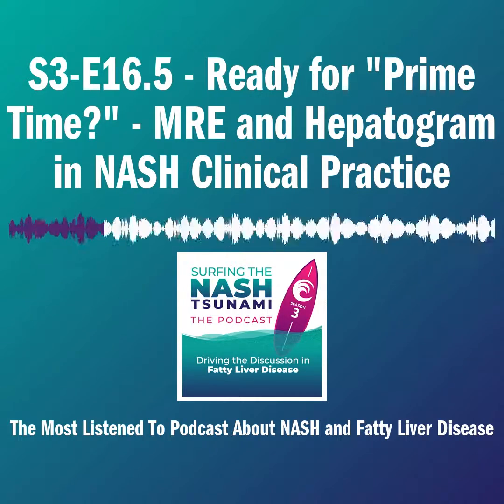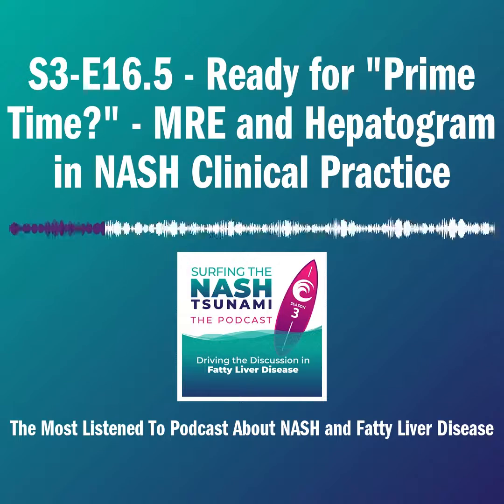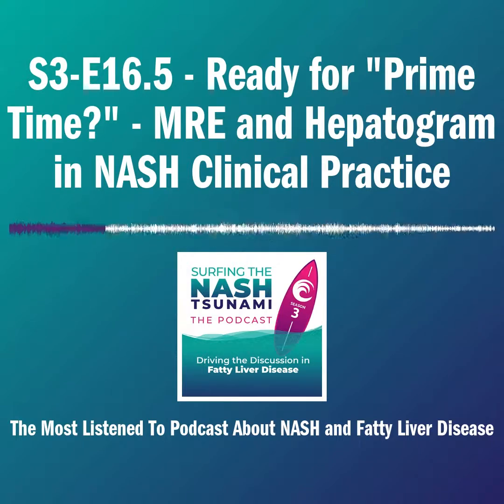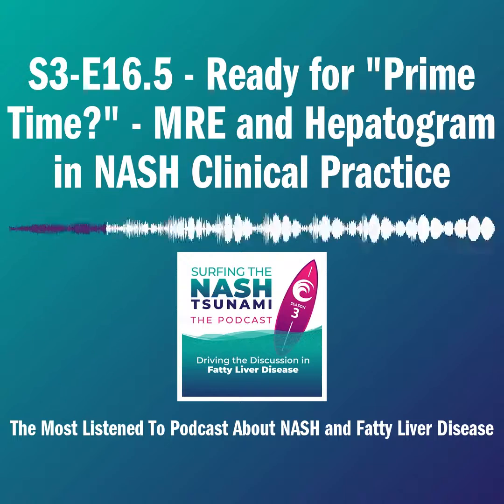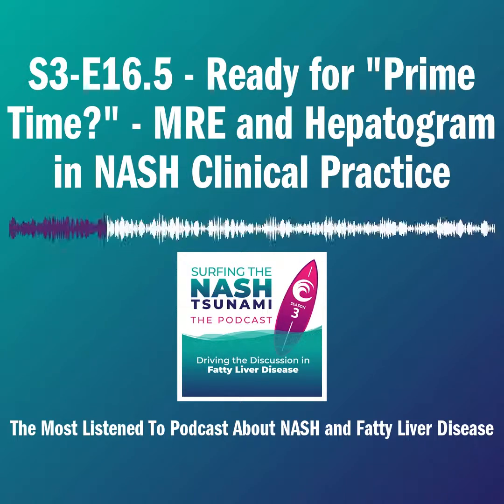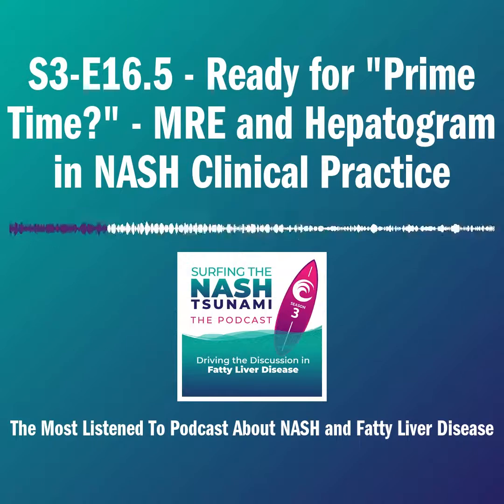We started with a derivation cohort. Although we have a lot of MREs, not everyone had a biopsy. So the derivation cohort was about 103 patients from Los Angeles, and they had paired liver biopsy, PDFF, MRE, and labs within a reasonable time frame. I think it was less than 6 months, to make sure there's no change in the patient characteristics.